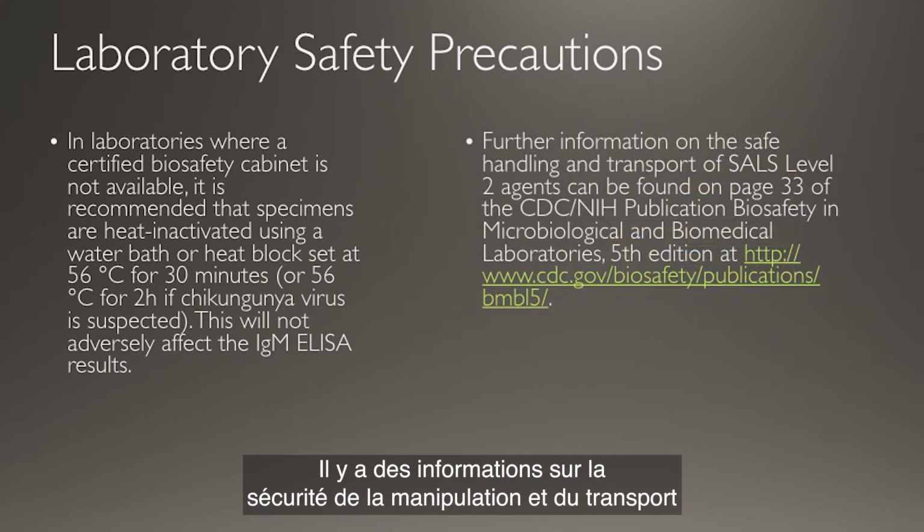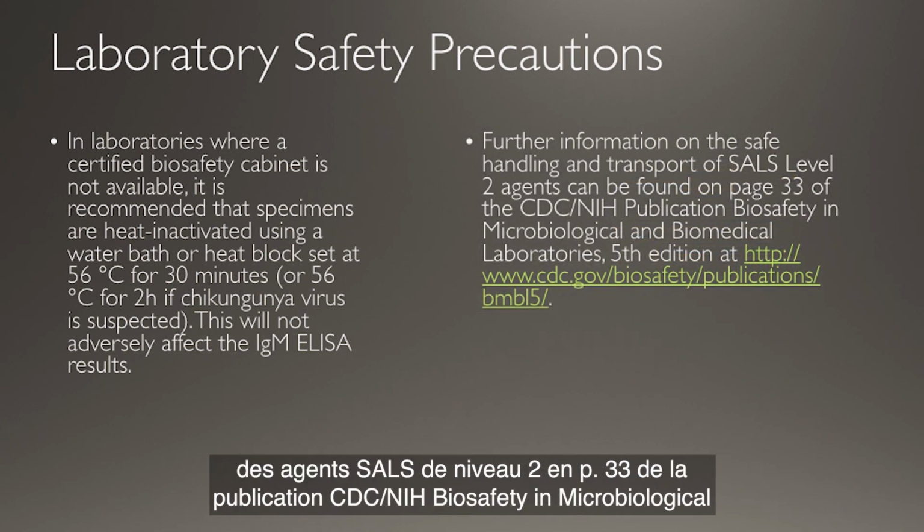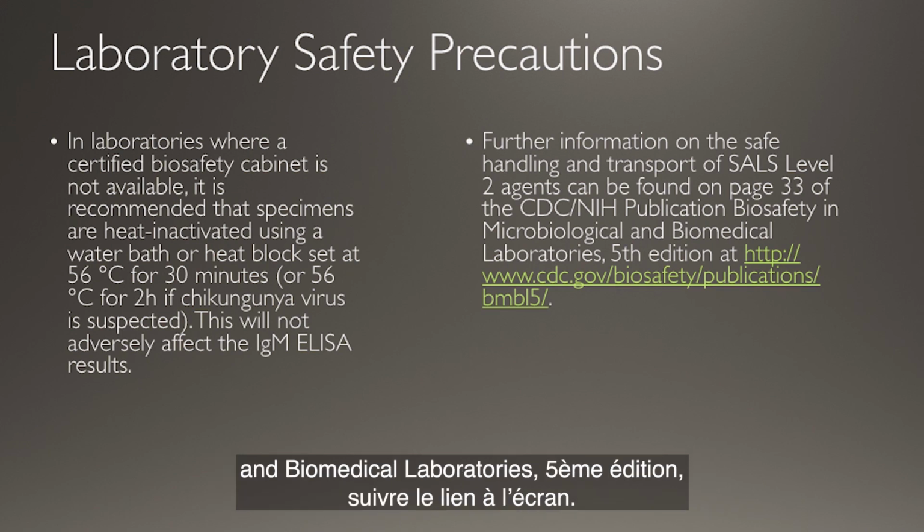Further information on the safe handling and transport of SALS level 2 agents can be found on page 33 of the CDC NIH publication Biosafety in Microbiological and Biomedical Laboratories, 5th edition, at the link shown on the screen.